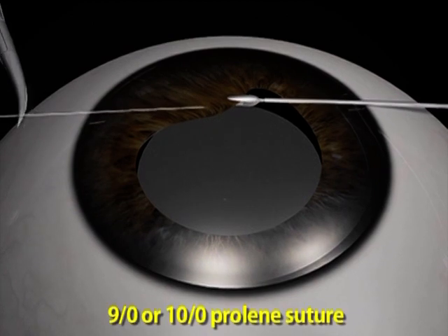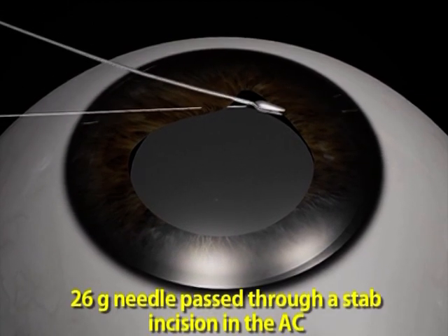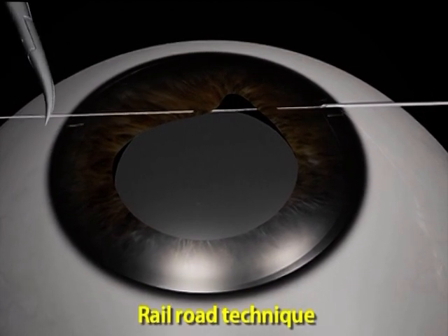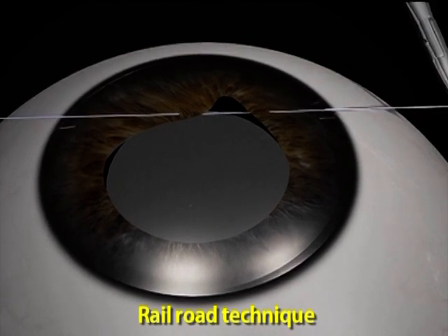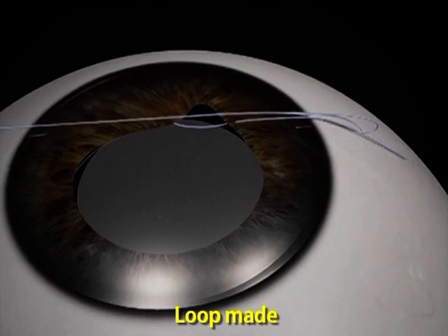First of all, catch the iris with the forceps. Pass a straight needle — 10-0 or 9-0 prolene. From the other end, pass a 26-gauge needle through a clear corneal incision into the iris. Do a railroad technique, pass the suture out, and create a loop.